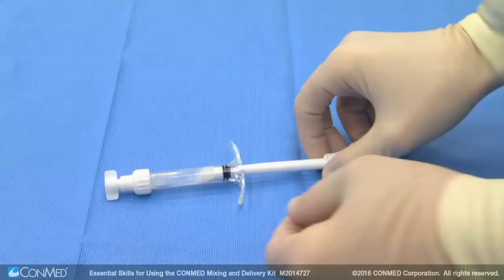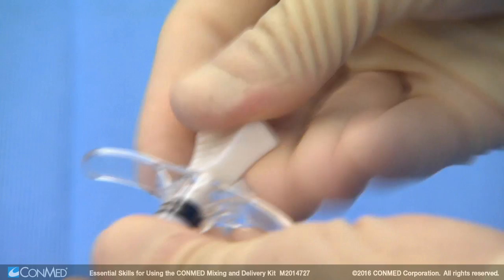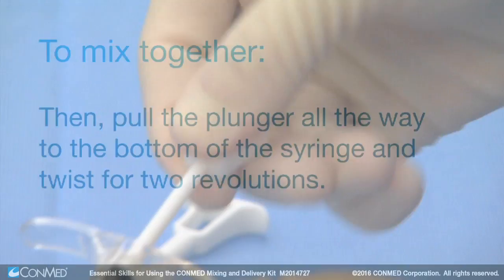Next, remove the push rod from the mixing element by applying counter pressure on the tip of the push rod. To mix the material and fluid together, first push the plunger all the way to the top of the syringe and twist for two revolutions. Then pull the plunger all the way to the bottom of the syringe and twist for two revolutions.